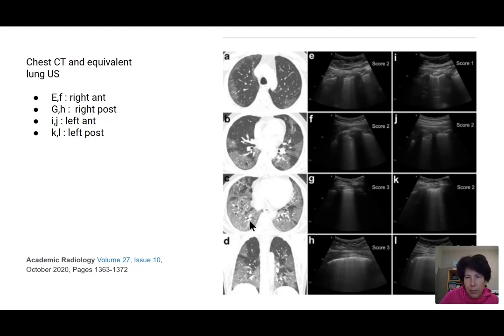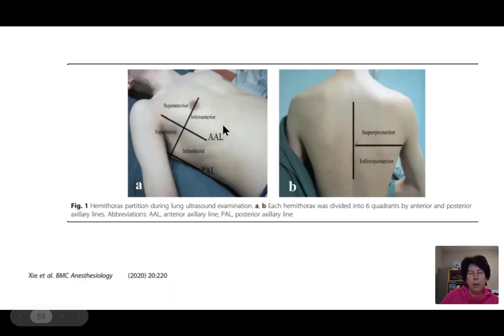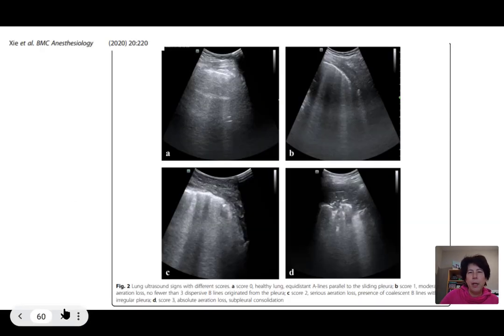Here you can see significantly more pathology on CT, reflected by this more coalescent, thickened pleural fractal sign, and this is on the left posterior. So they're still scoring this 2, although I would say that this is starting to come up to a 3 probably. So just again, showing that different studies have different ways of dividing the lung.